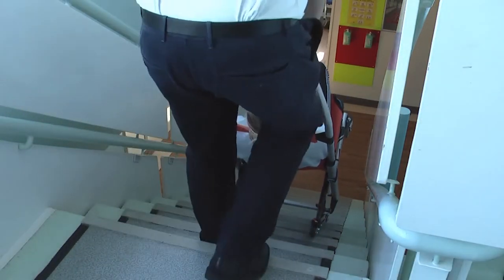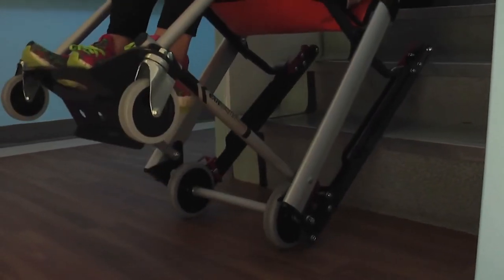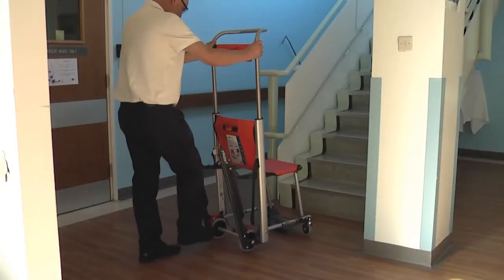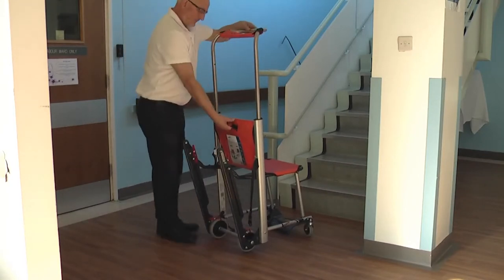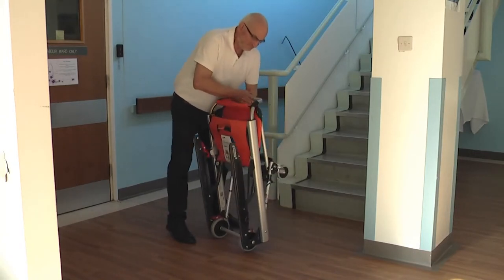The track offers superb grip and control on the stairs. Once at a safe area, transfer the user from the Versa Chair to a regular wheelchair or chair to enable the Versa Chair to be used for additional passengers. Apply the brakes to the Versa Evacuation Chair, release the stair blade lock and fold up the seat to allow the product to be carried up the stairs for further evacuation.